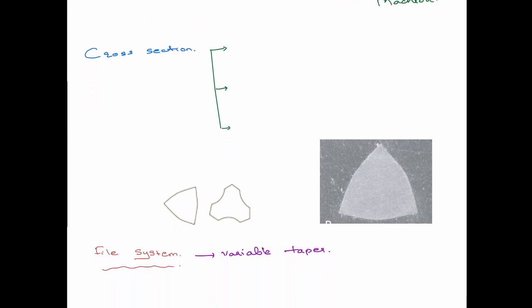About the K3 system, they are not explaining much about the cross section, but in ProTaper they are talking about 2 cross sections, and mainly it is a kind of modified K file. They're saying that the cross section is like a modified K file. You know, the K file has a square cross section, or it can have a triangular cross section. Though I know you have studied it as square, remember K file and reamer can be designed as both square and triangle, but K is much more designed to be square and reamer is much more into the triangle cross section, but it can be done as both. If you go into depth of the standard textbook, you'll see this.